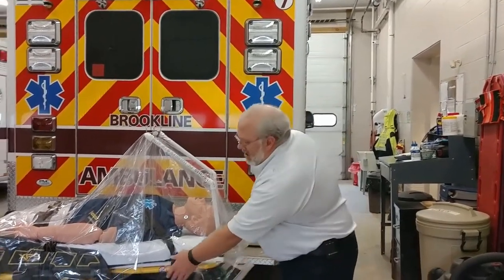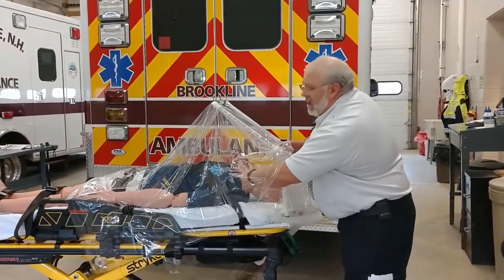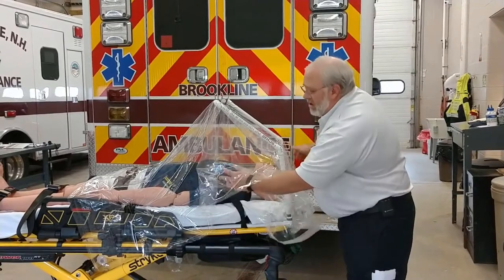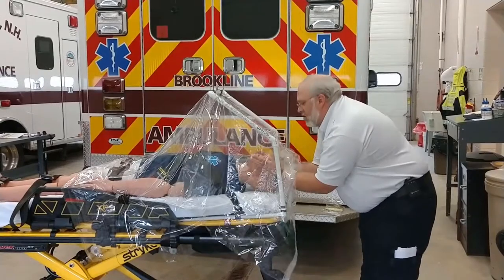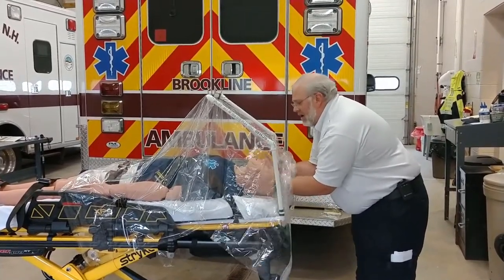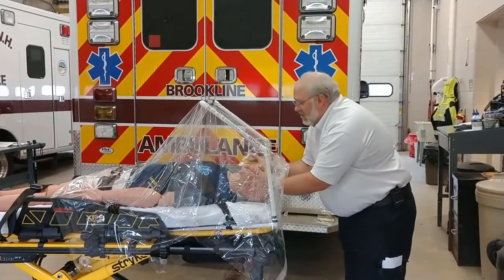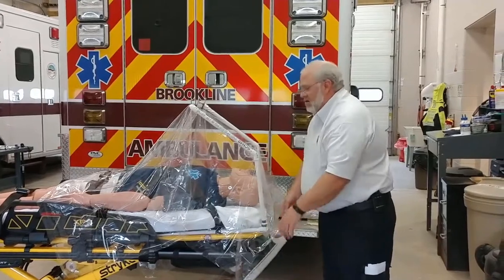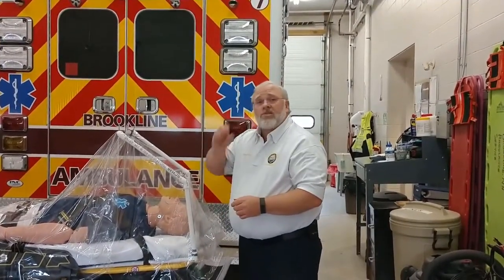It allows our providers to access from either side — if you need to be on the patient's left or right, you can just lift up the drape. If you're performing an intubation or another airway maneuver, you can put your gloved hands up underneath and perform your intubation or manage the airway with a bag valve mask, and that will keep the aerosols inside.